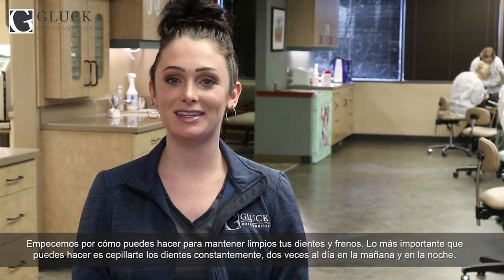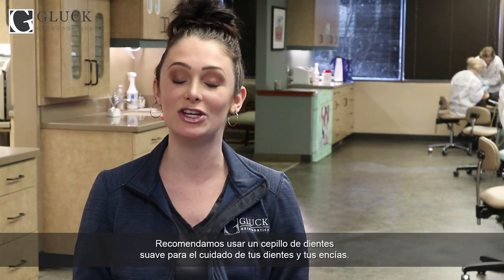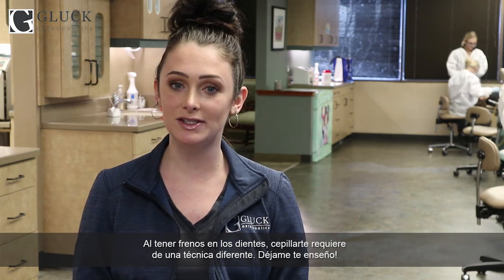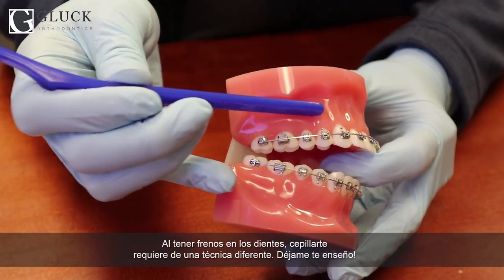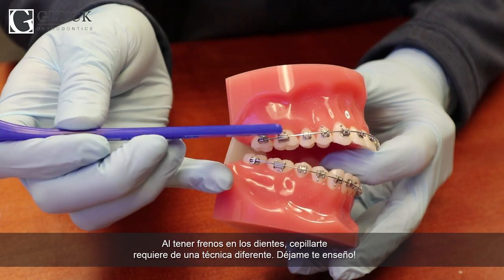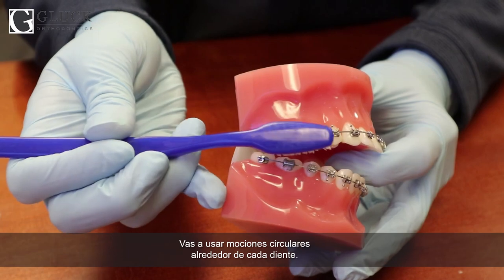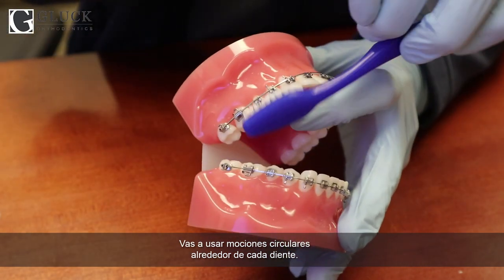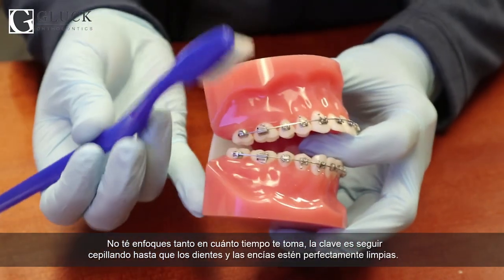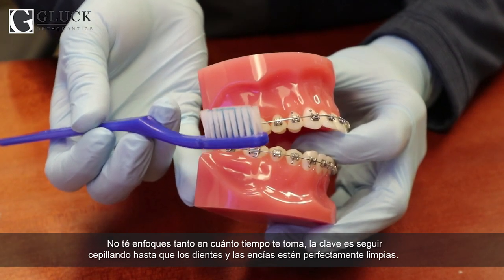Let's start with how you can keep your teeth and braces clean. The most important thing you can do is brush your teeth consistently twice a day, morning and night. We recommend using a soft toothbrush as it's gentle on your gums. Since you have braces, brushing requires a different technique. Position the bristles of the toothbrush above the braces so that you are cleaning the area between the braces and the gums. Use small circular motions around each individual tooth. After finishing that part, you can clean the tops and the edges of the teeth. Keep brushing until the gums and the teeth are perfectly clean.